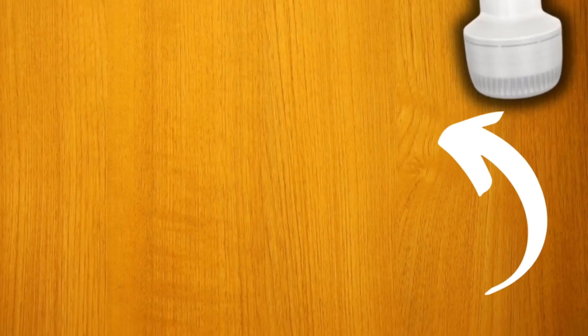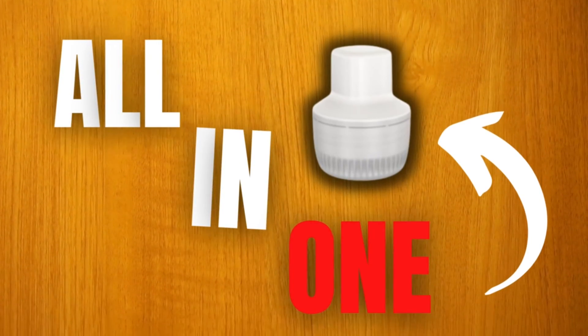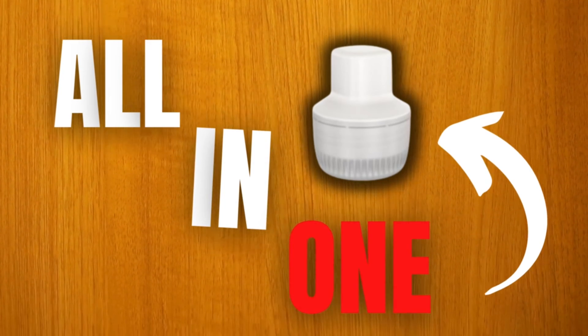The first really big change is that the sensor and the transmitter are all built into one convenient part. This is similar to the Freestyle Libre 3 and the Dexcom G7. Combining the two together may seem like a small change, but there are a few reasons why this is a pretty big deal.